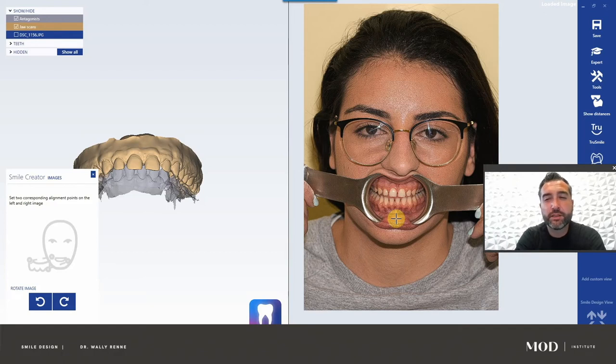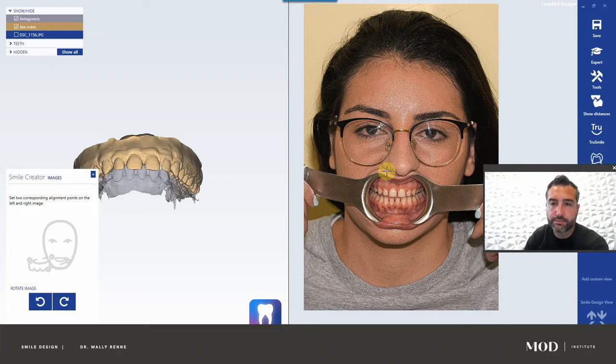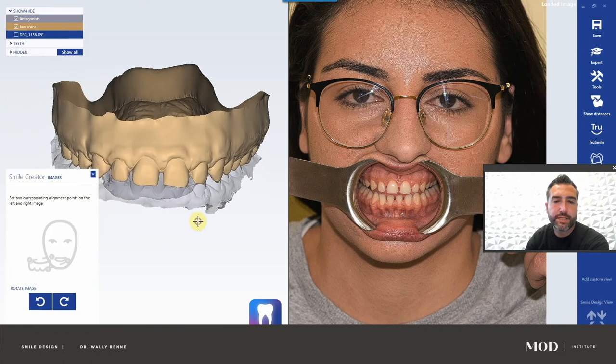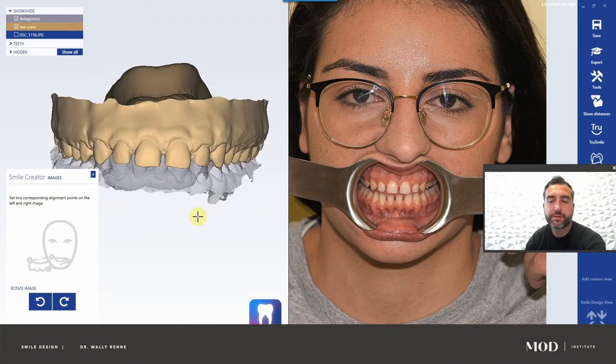In my opinion, everybody always asks why not just do 2D? Well, it's actually a little bit technique-sensitive with 2D photos. Learn from my mistakes. There are a few ways you can get the patient's head to stay in the same position. One is use a tripod and just have the patient in a chair. What I like to do is have the patient hold an object against the wall with their head in such a way that they can't move.